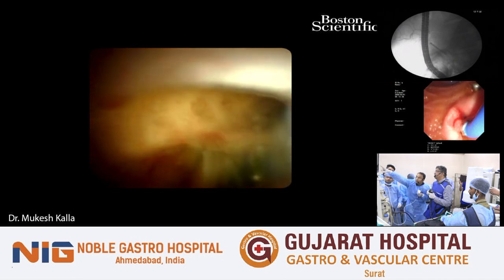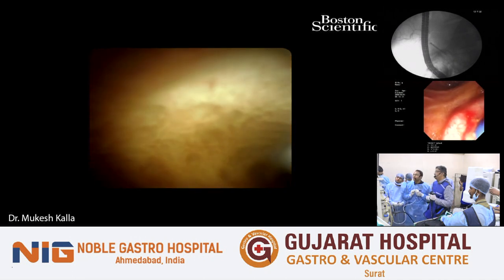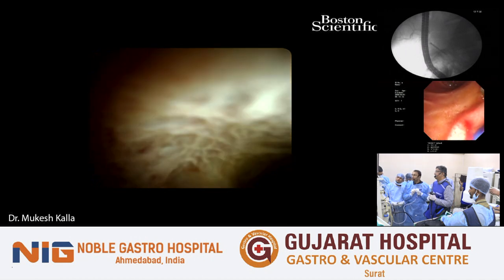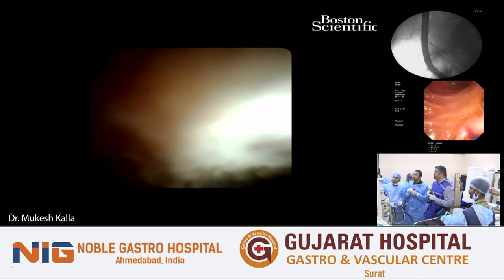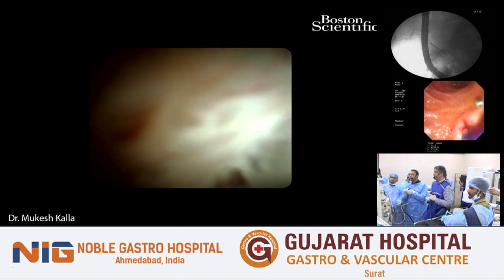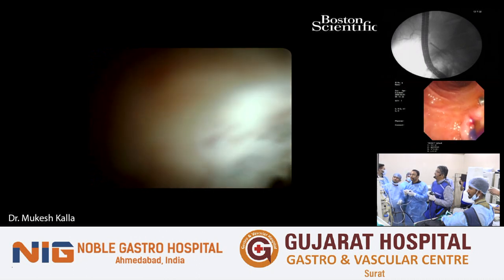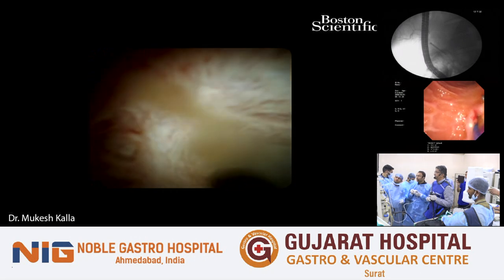Now here we'll try and find out. I will ask Somil to manipulate and go inside the cystic duct. I think this is a cystic duct, and we'll try and correlate. There are two ways of saying that we are in a cystic duct. One, we are not seeing the hilum. Two, we go and stand against the wall of a cystic duct, because this is a post-cholecystectomy status.